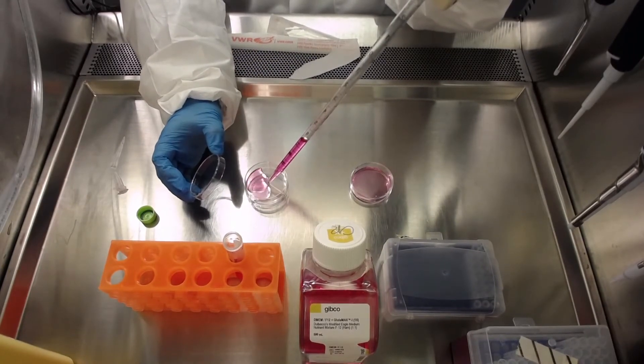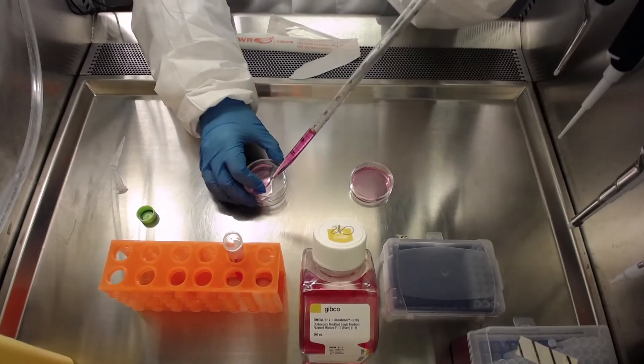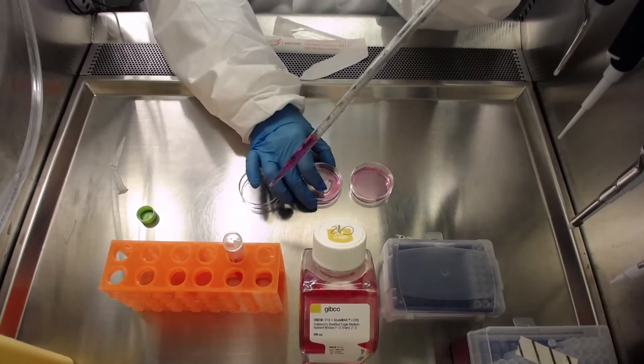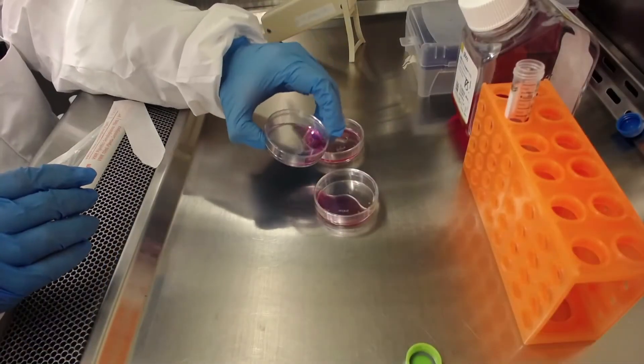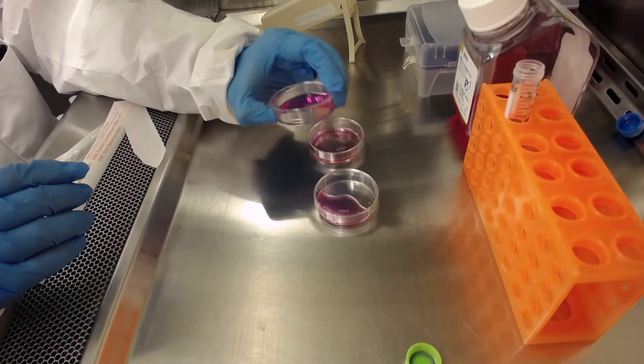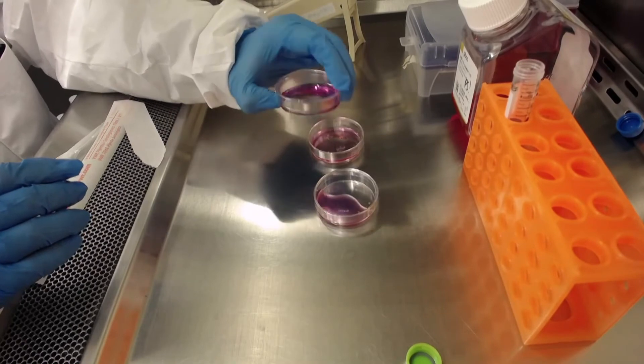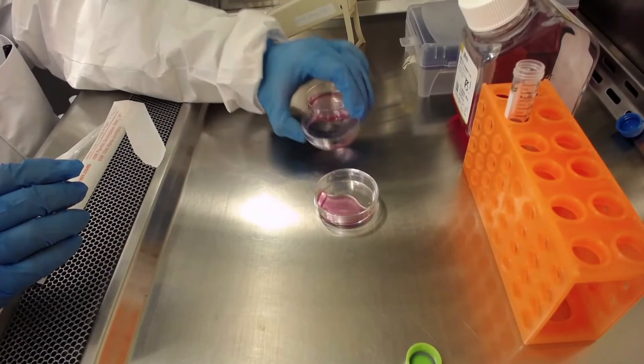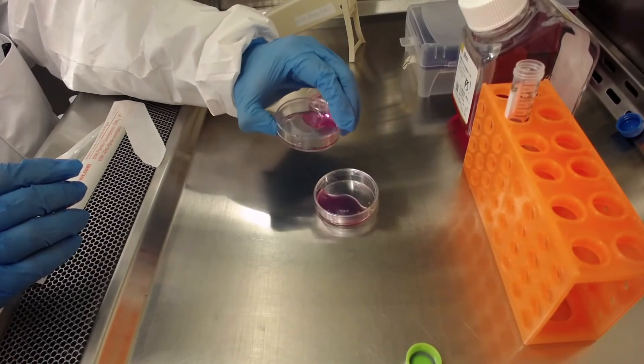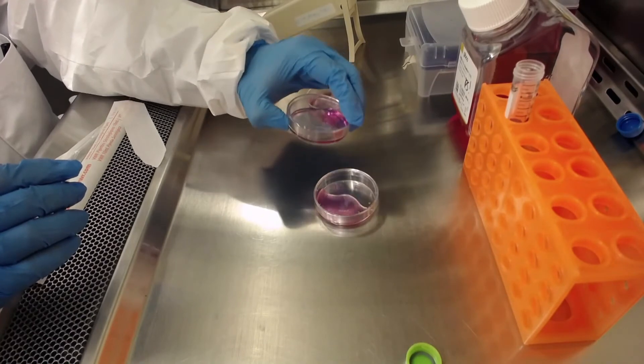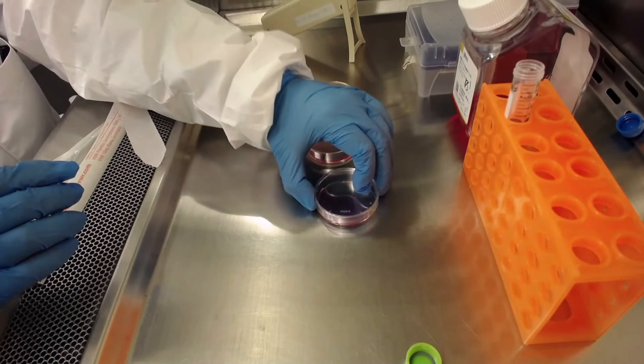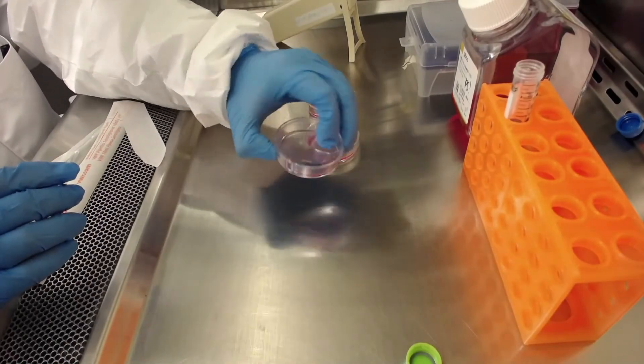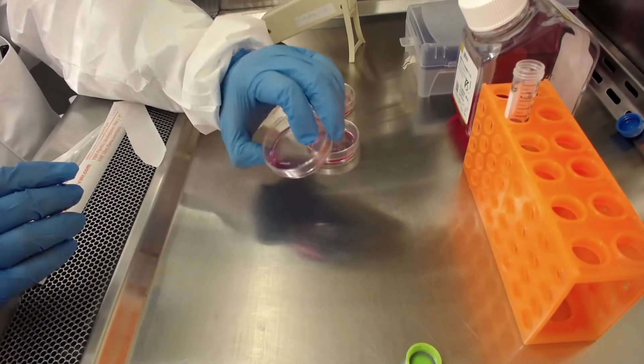If using a 10 cm dish, add 5 ml per dish. Swirl and rock the dish to ensure even coating. Make sure there are no dry spots and that the solution is evenly distributed. Improper coating will prevent proper cell attachment to the surface of the dish.